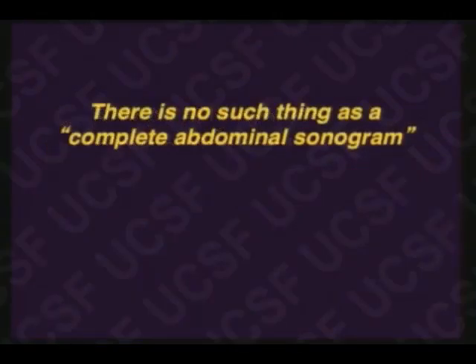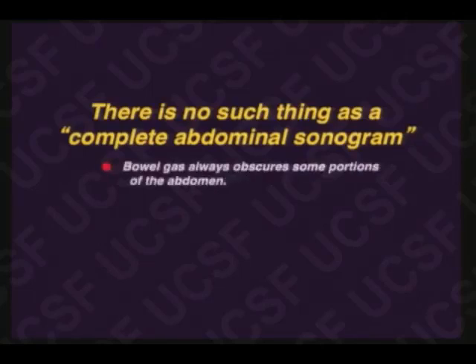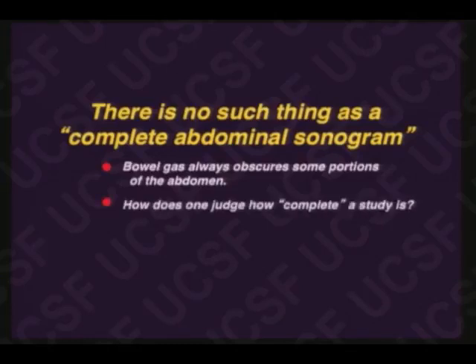What we're going to be talking about is the identification of fluid collections. Now, I realize that 5 times a day, most of us pick up a dictaphone and say, complete abdominal sonogram, but of course we all realize there's no such thing as a complete abdominal sonogram. Bowel gas is always going to obscure some portions of the abdomen. So then, how does one judge the completeness of a study?